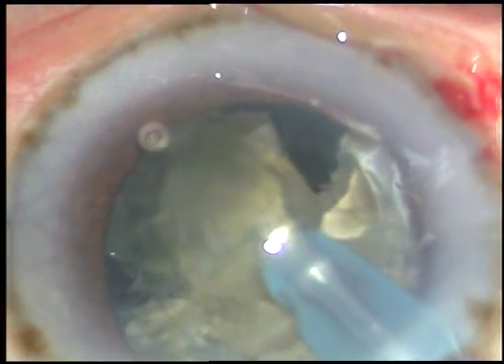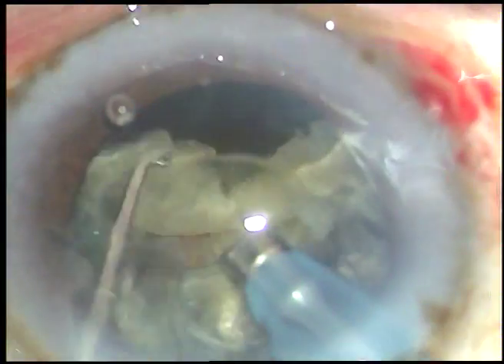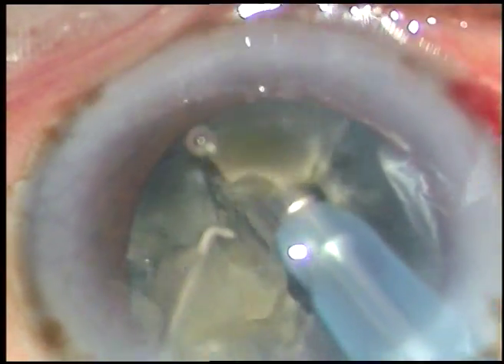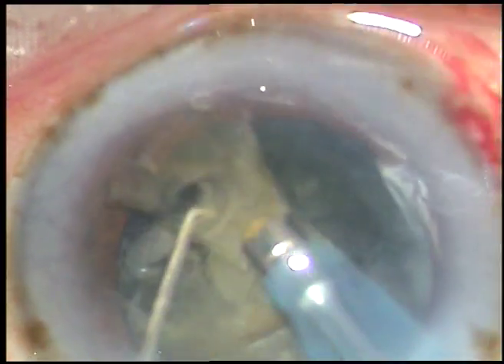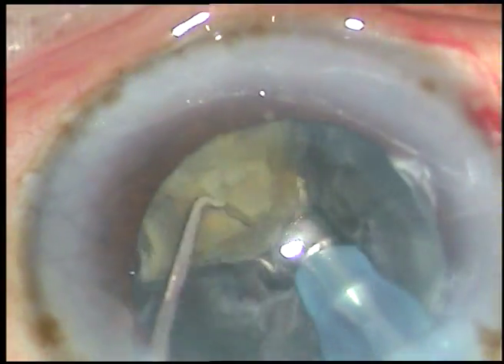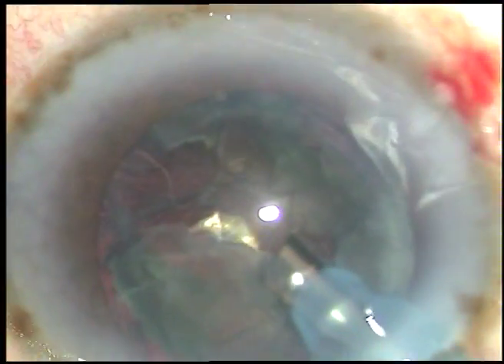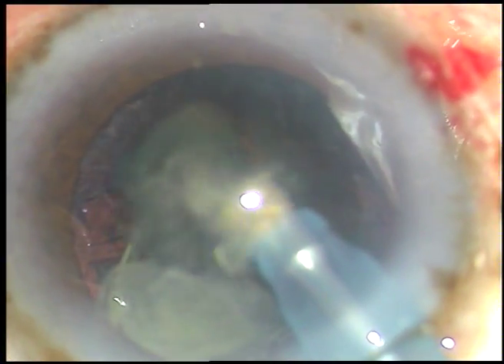Each fragment is brought to the center of the anterior chamber at the capsular plane. We can see the rhexis margin and make out the plane of the anterior capsular rim. We emulsify the nuclear pieces at the center of the capsular opening. In that way we remain at a safe distance from the corneal endothelium as well as from the posterior capsule, and thus we prevent both endothelial damage and posterior capsular rupture in routine cases.